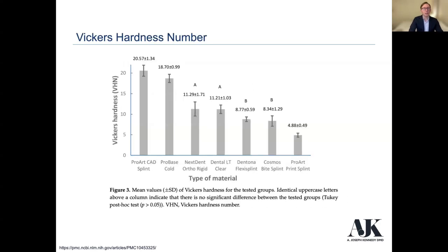If we look at Vickers hardness, again, same kind of thing. The ProArt CAD splint is at the top. Slightly below there in Vickers hardness is the Pro Base Cold, which is a more conventional approach for PMMA. And then we jump into the resin-based types.